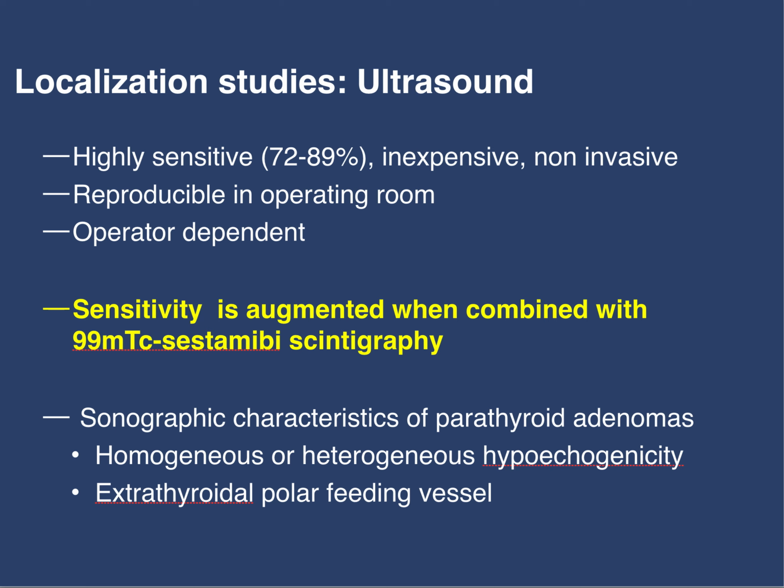Parathyroid adenoma with ultrasound localization, pretty good, but it requires somebody that knows what they're doing. A usual thyroid ultrasound is not going to identify it, so we want a competent technologist or competent sonographer who knows where to look. We used to have an endocrine surgeon that practiced at FITS that retired, and he generally liked us to do a combination of both sestamibi and an ultrasound.